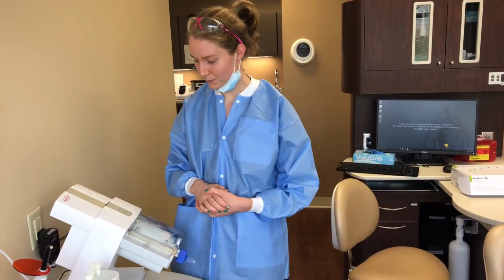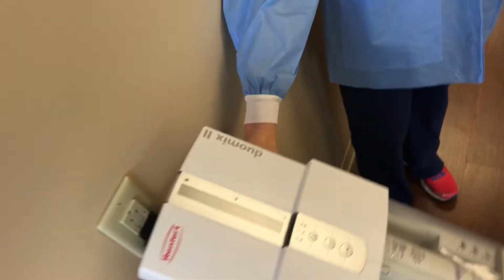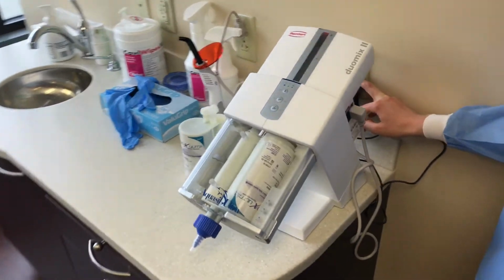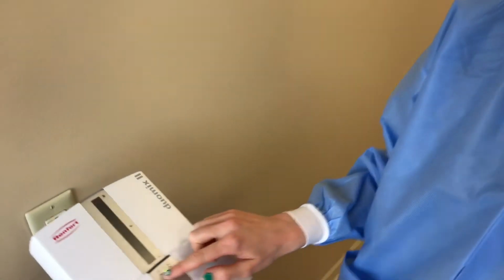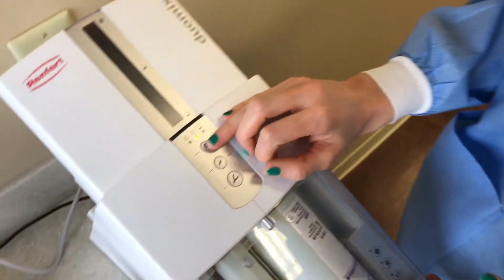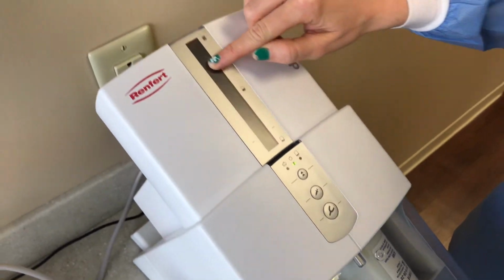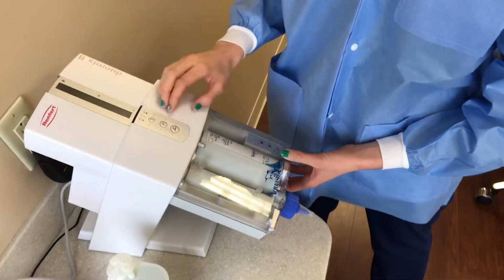So the DuoMix here has a power switch on the back right side, and it plugs into the wall so it can be conveniently stored countertop in the operatory. At the top here you'll see an arrow button that allows us to reset the mixer once we want to insert a new cartridge.